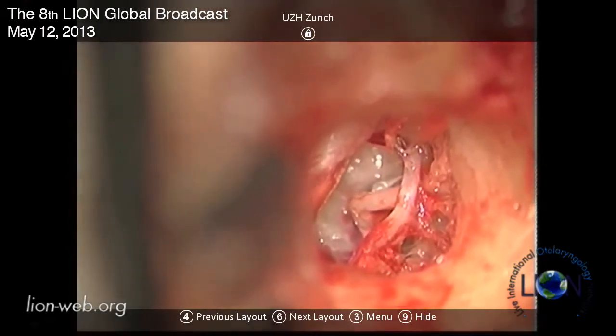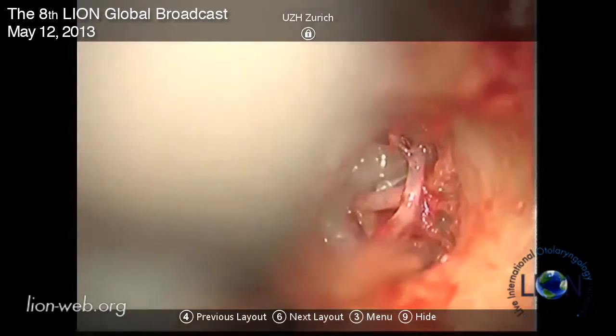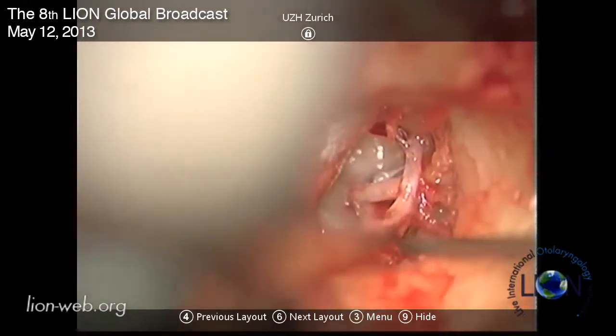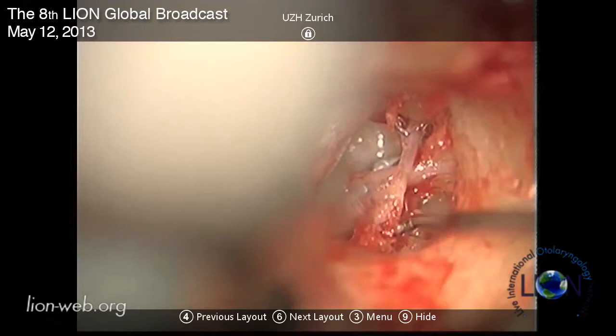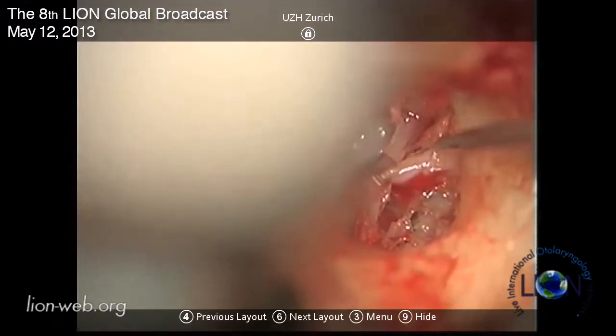We can see now the stapes and the incus nicely. I will now just open this mucosa part here so we have good access and a good view onto the stapes and onto the incus.